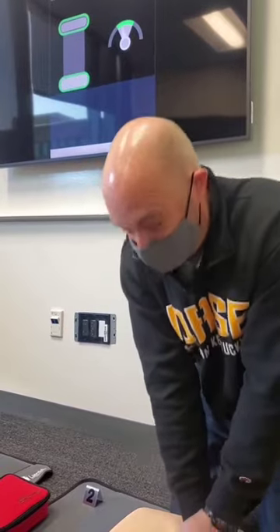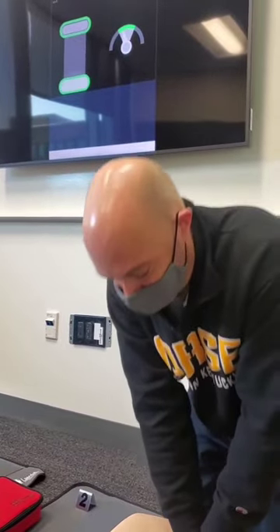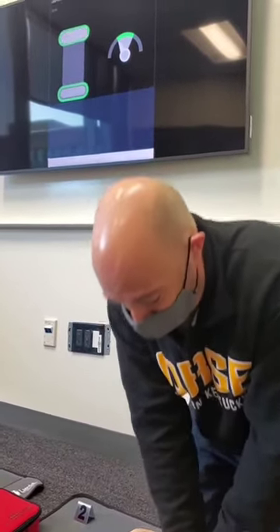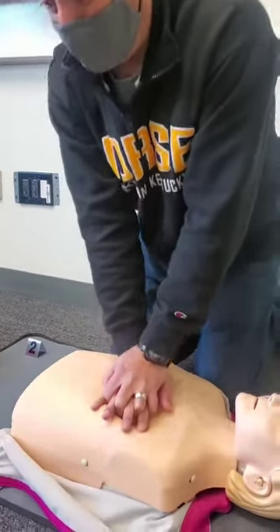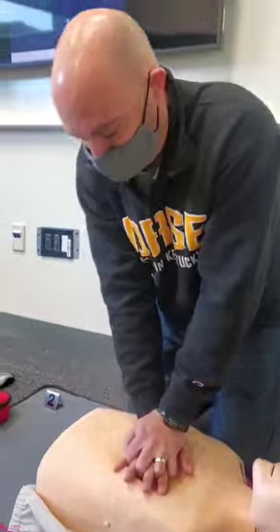On the right you'll see a gauge showing if I'm going fast enough. You want to go at a rate of 100 to 120 times a minute. If I'm going too slow, I'm not going to be effective at all.